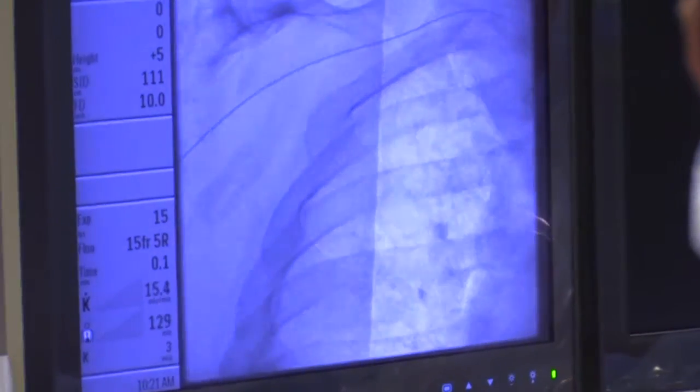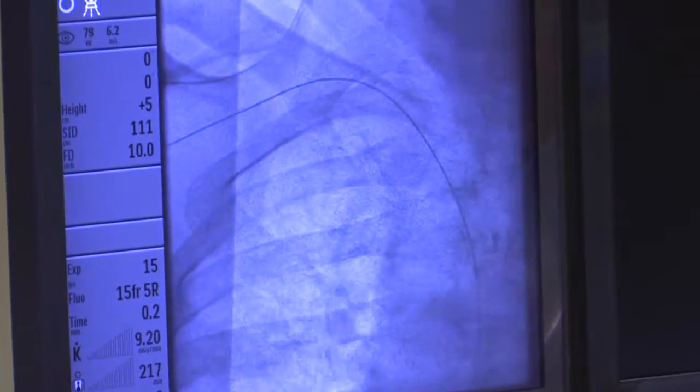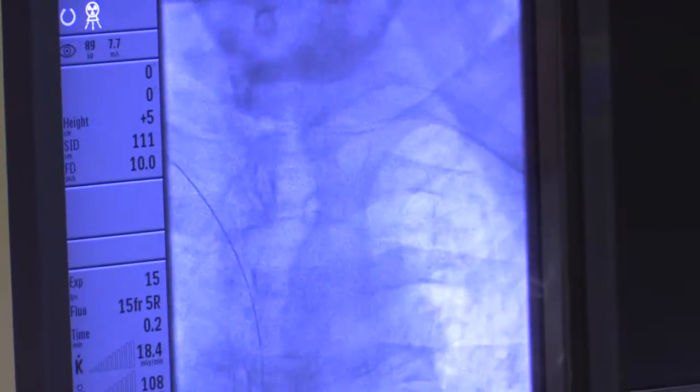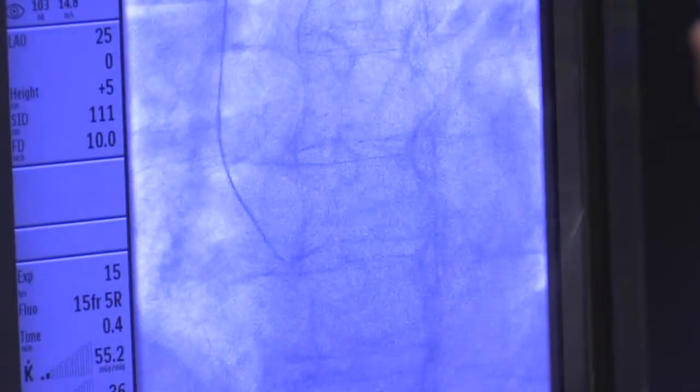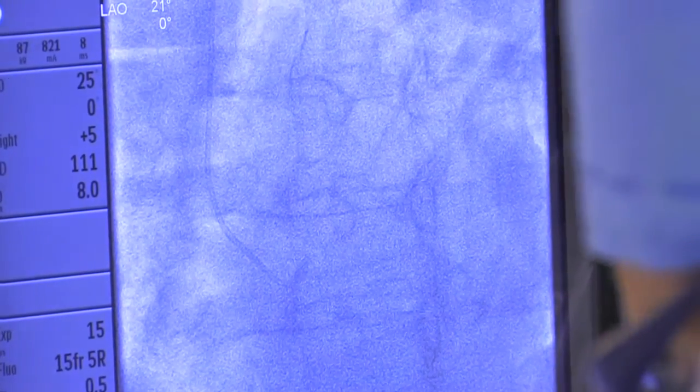You can see the guide wire — we're tracking it up through the brachial artery, subclavian, and we want to get it into the aorta. Now I'm going to track the catheter over. You can see the wire is in the aorta and it'll bend when it hits the aortic valve, right there. So we know we're at the bottom of the aorta. Then we pass our catheter and remove the wire, and flush the catheter carefully to make sure there's no air or clot.